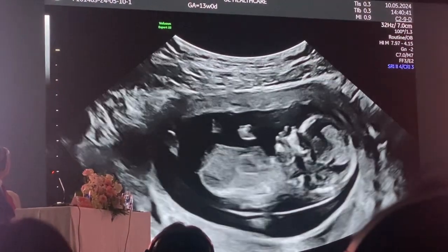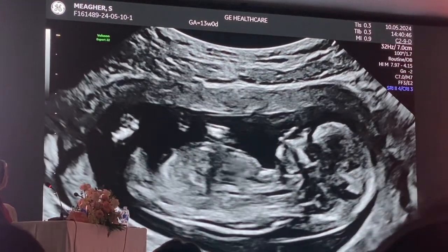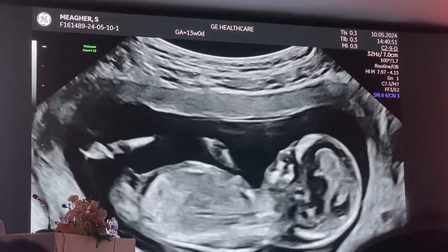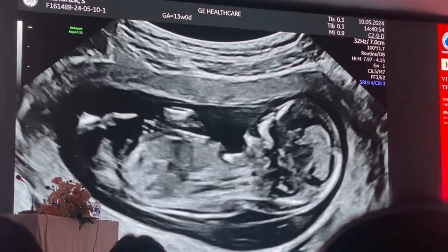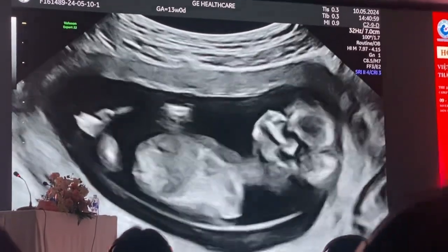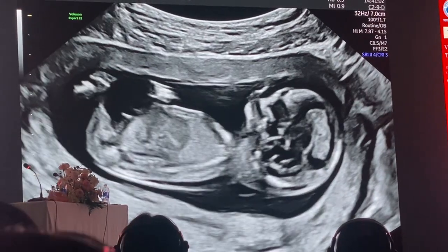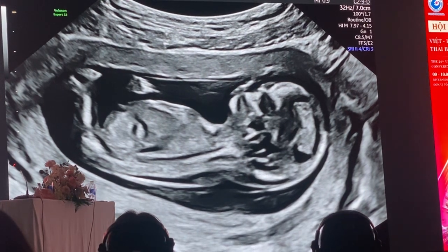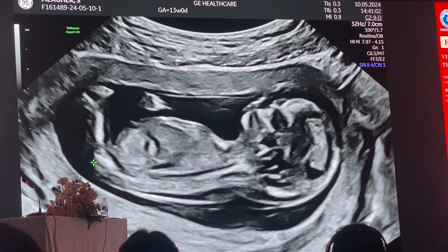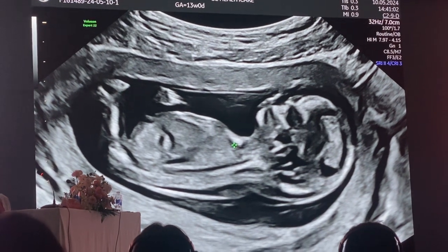And once I reduce my depth, I'm just going to slightly rotate my transducer, and I'm now going to very slightly magnify. My dynamic range is at 7. I'm just going to slightly increase my dynamic range, and I need to catch the rump end of the fetus. When you're taking a sagittal section, you have the nuchal fluid in view, and you have the nasal bone. When I press calc, I go to crown rump length, and I measure from the rump end of the fetus up to the crown of the fetus, and I press enter on that.